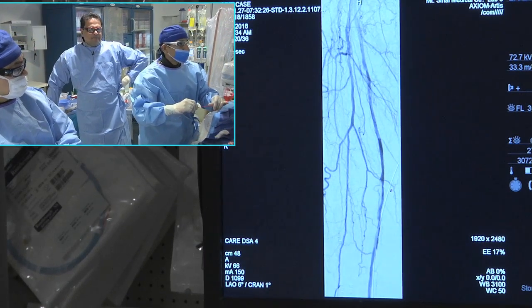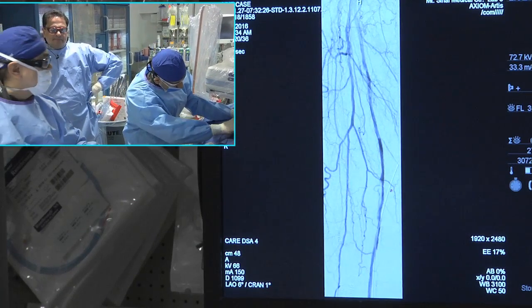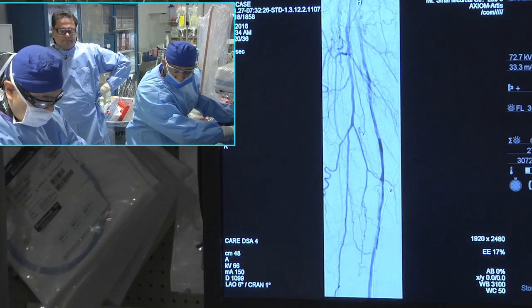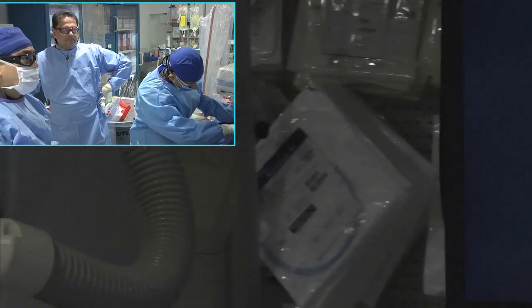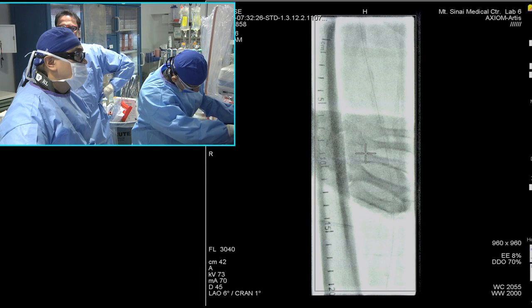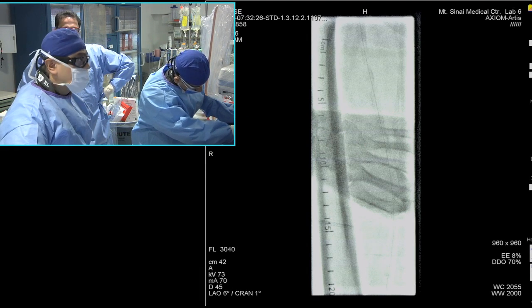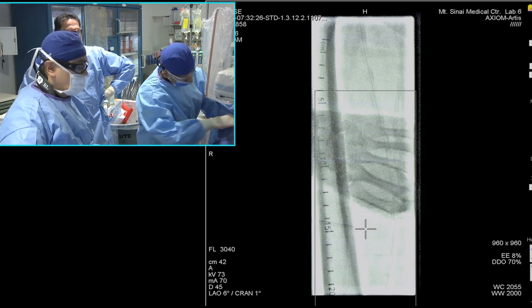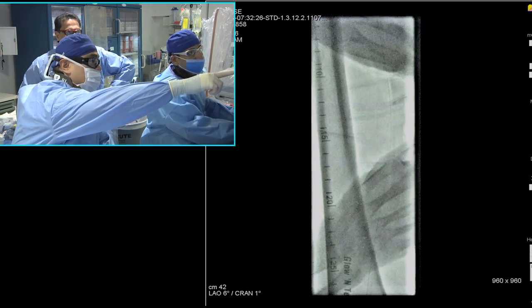So could you say that 1 microgram is going to make a difference? It's hard to say. Again, you have to go on to the microbiology and all that stuff for it. But the pathology of it. But I mean, for me, personally, on a clinical basis, especially following up these patients with serial ultrasounds, I haven't seen a big difference between using one category of balloon, whether it be Lutonix versus the other one on a head-to-head. Unless there is a head-to-head trial, I think it's just a class effect that comes into play.